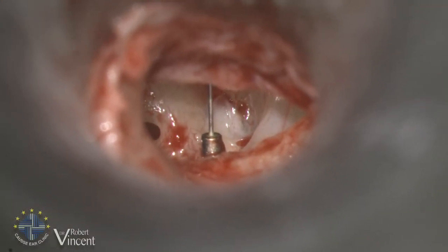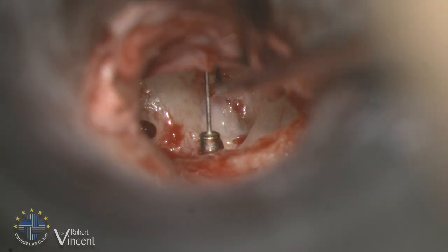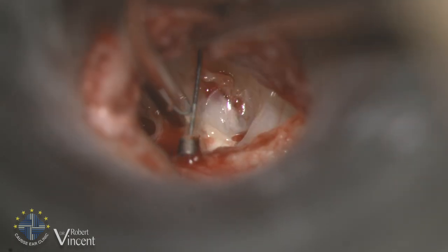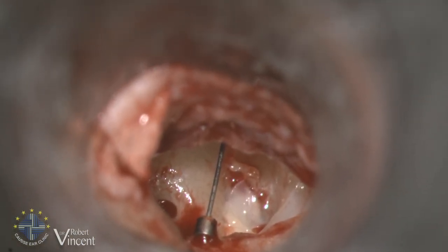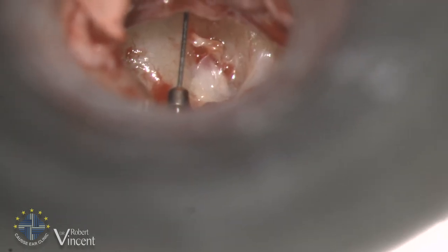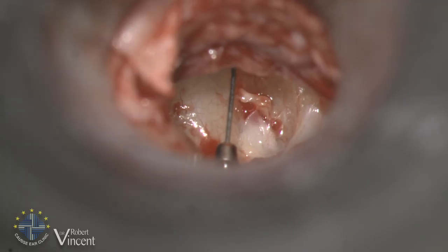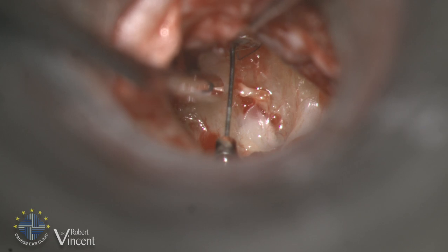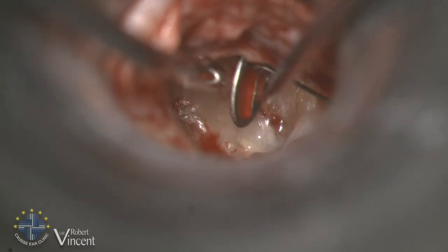I will use the malleus prosthesis to recreate a malleus handle. Because of the number of surgeries she has had before, we decided to stage the procedure. I will put a malleus prosthesis first, and then after six months I will do a second stage with placement of a TORP. I prefer in some cases to do it in two stages, because the malleus replacement will take time to stabilize underneath the lateralized tympanic membrane.